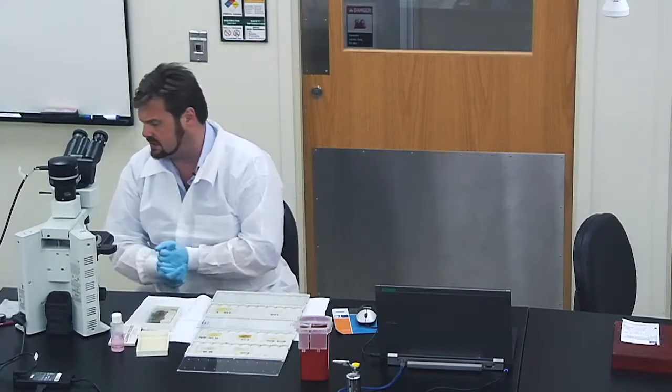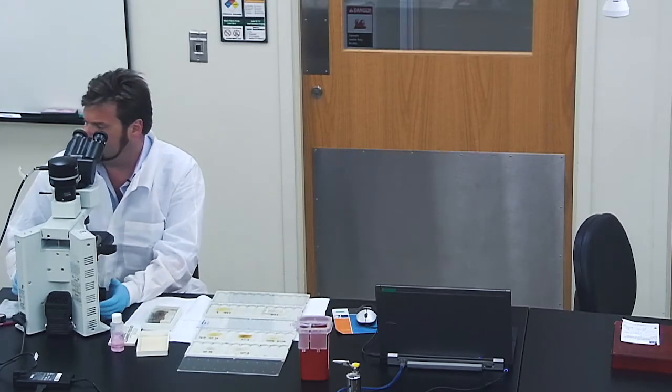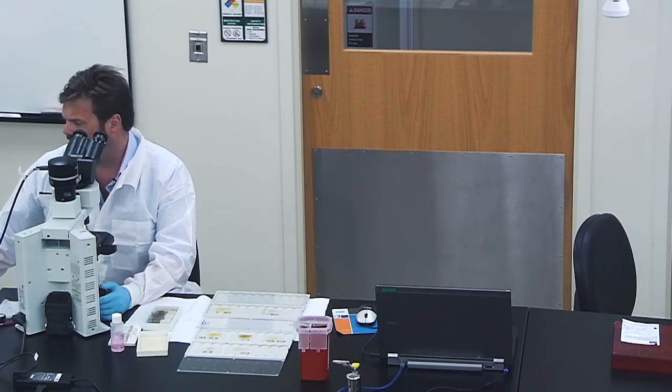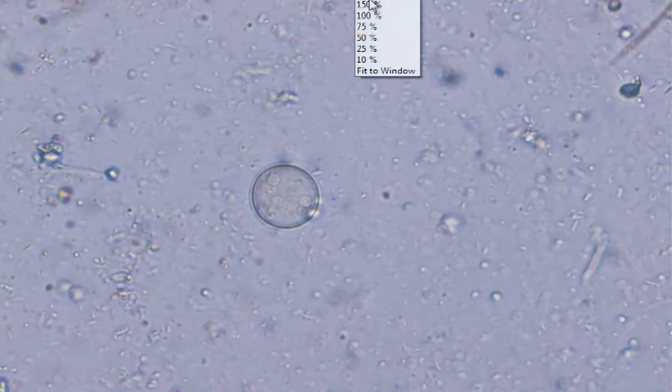What I want to do for the rest of this webinar is go through the actual organisms under a microscope. This is the bit which I think most of you will get the most out of. So here I have a wet prep, and you can see a lovely Entamoeba cyst. You see the very, very defined round cyst wall. That's very specific. Let me zoom in a little bit.